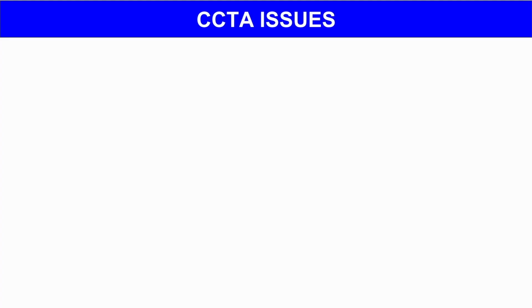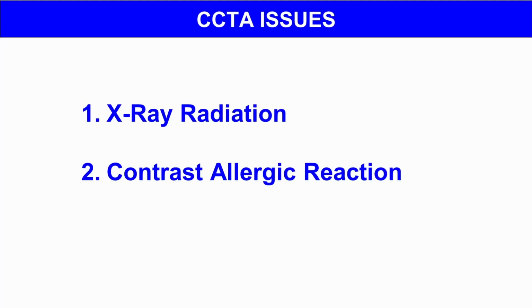Well, a couple reasons. First, it exposes you to a lot of radiation, so you want to limit how often you get this done, which means it's not appropriate as a simple preventative screening. Second, some folks, like me, are allergic to the contrast dye they inject in you to enhance the imagery. Only about 2% of the population has this issue, but for those of us who do, it is miserable.